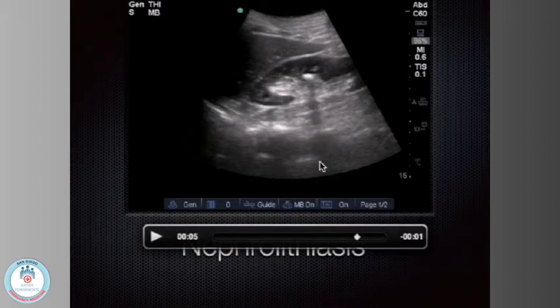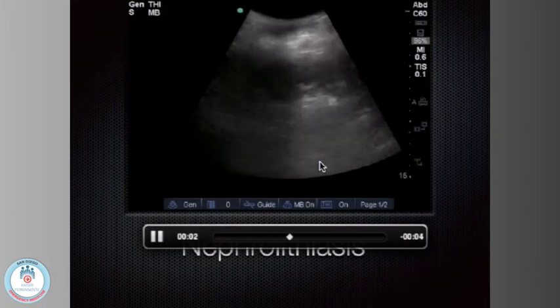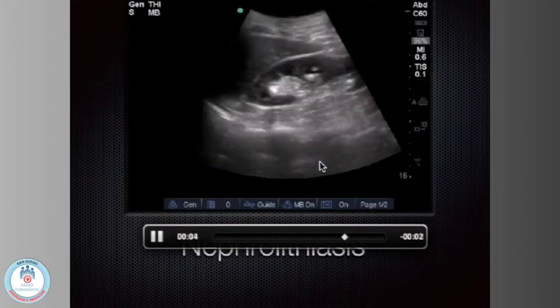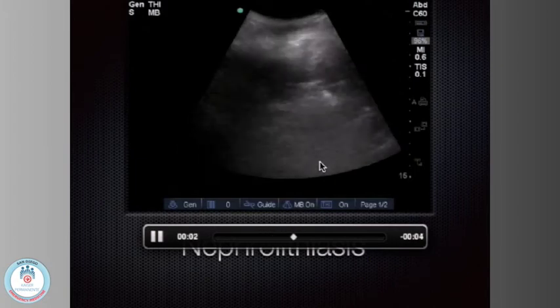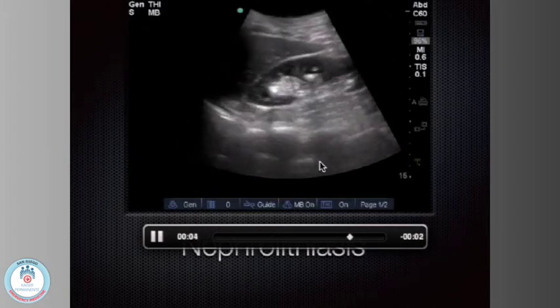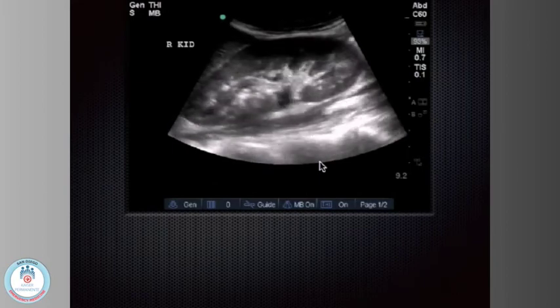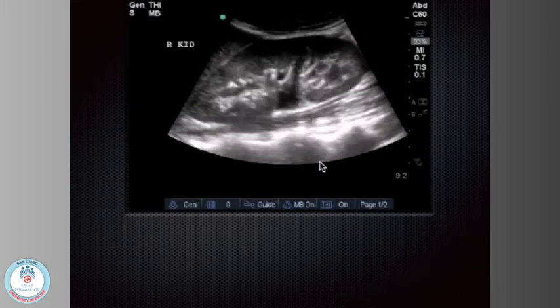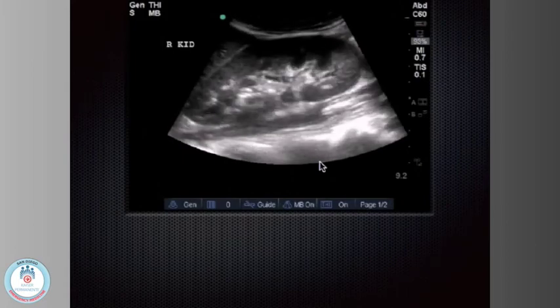The nice thing is when you do this in real time, you can always stop the machine and back it up, and you're not sitting in the audience getting pimped in front of your colleagues watching this ultrasound video. And if the resident had optimized the depth, it would be that much larger. The depth's here at 15. I would have taken that to a smaller number, so it would make that larger. What about this?